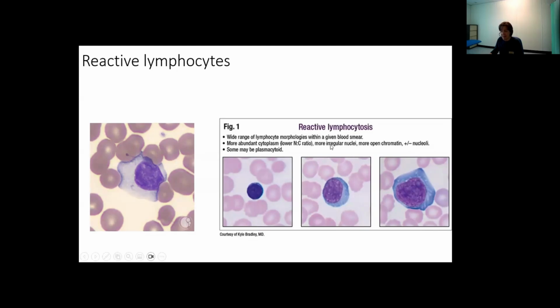But of course, reactive lymphocytes can vary in themselves. The important thing to note is that if you look down the microscope and you've got lots, the lymphocytes are all looking slightly different. So we would describe that as being pleomorphic. They're not all monomorphic. They're not all exactly the same, but there's a variety. You've got some small, some medium, some large. That is much more a feature of a reactive process, something that is reacting, commonly to infection.